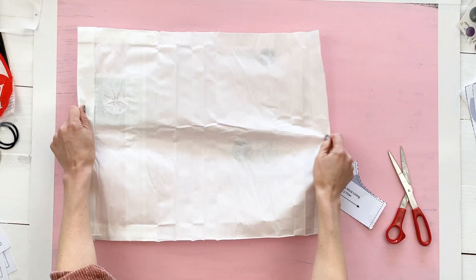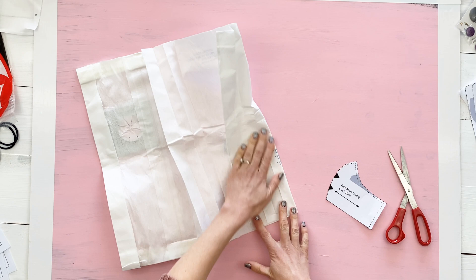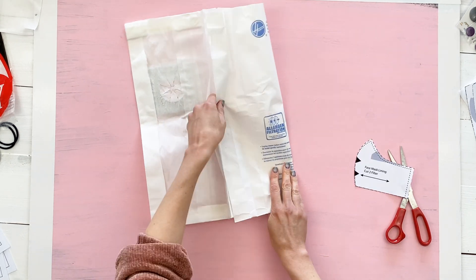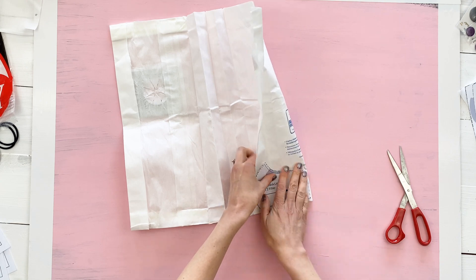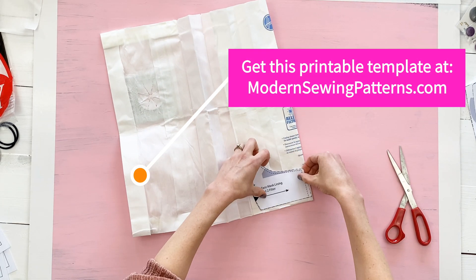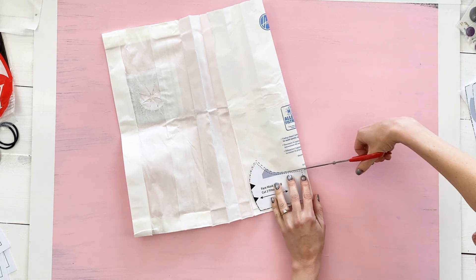From here you're going to treat it like any other fabric and cut two filter pattern pieces. The only difference when it comes to working with your vacuum bag is when it comes to sewing — you're going to use a wider stitch length.